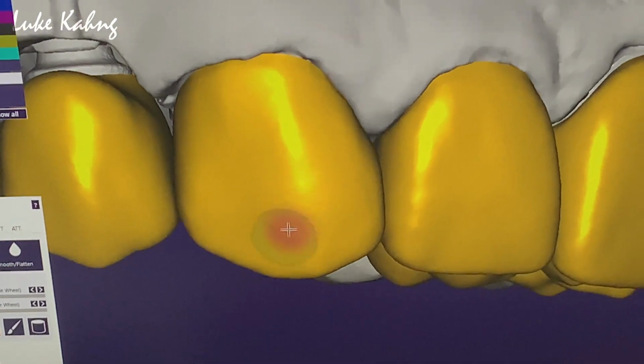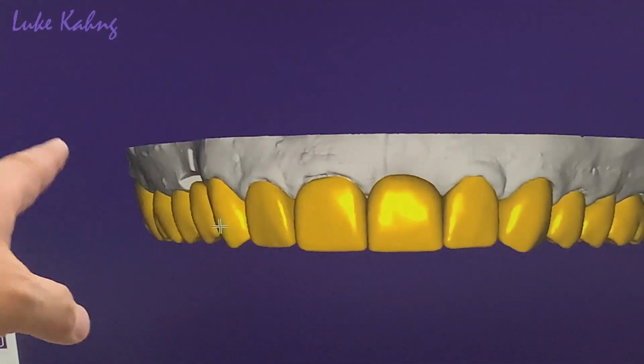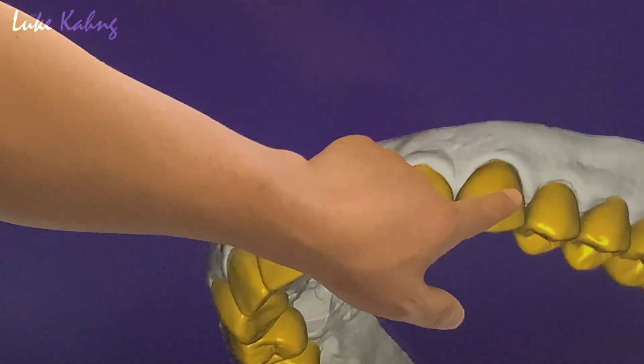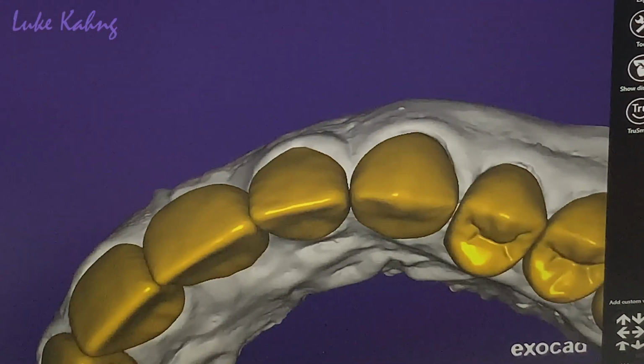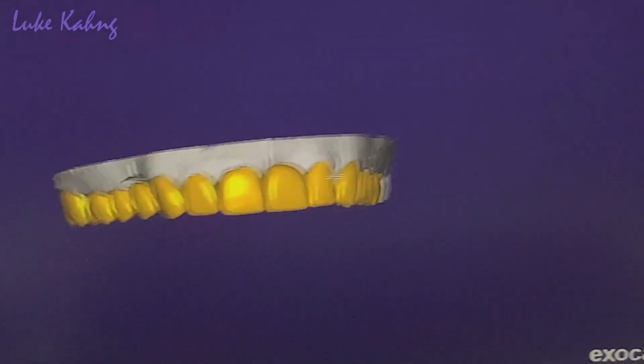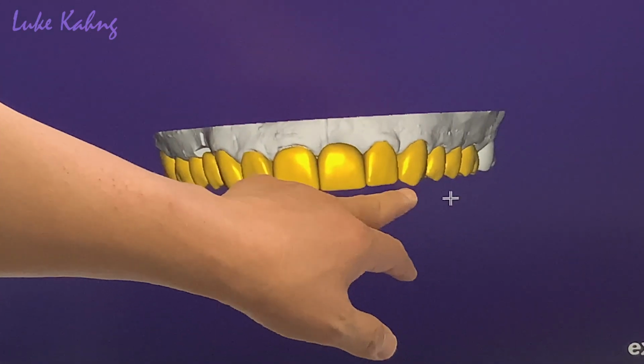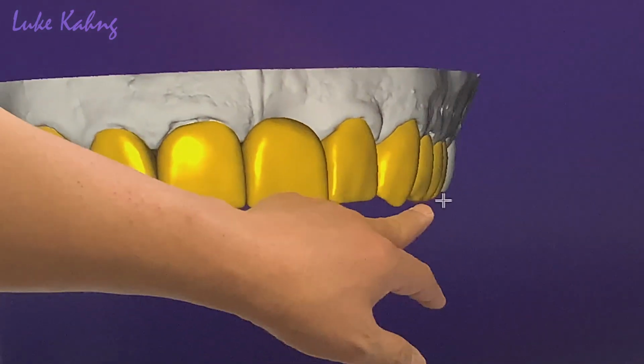Let me see the photo. Frontal view, much better. See, much better. I like this. Just cut it on the facial, a little bit, bring it down. Okay, much better. Now, you see, always the premolar is not longer than this, not the same as this. This is better.